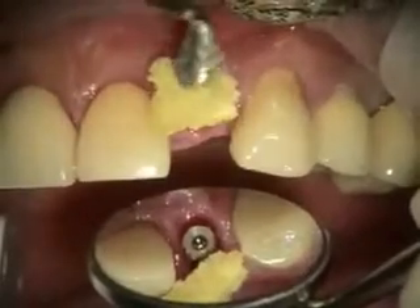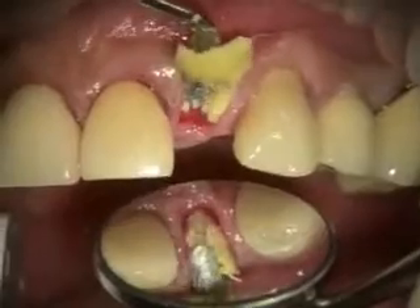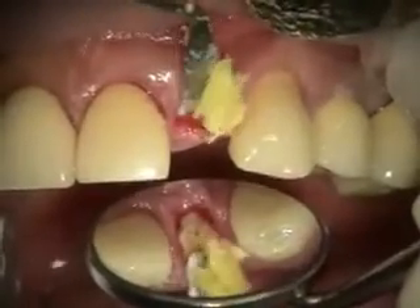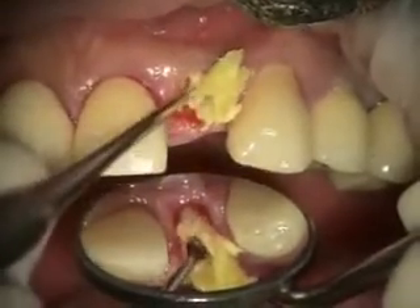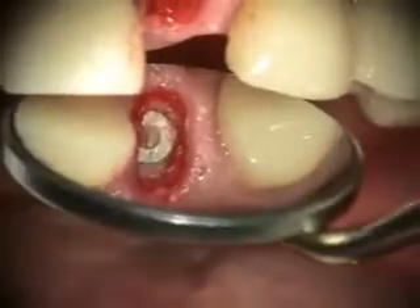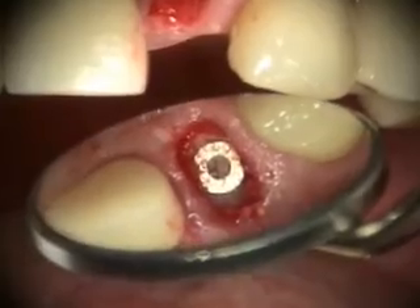We're grafting now. Most of the space defect is on the facial. We've got our space defect grafted and we're going to get ready to make a provisional now.